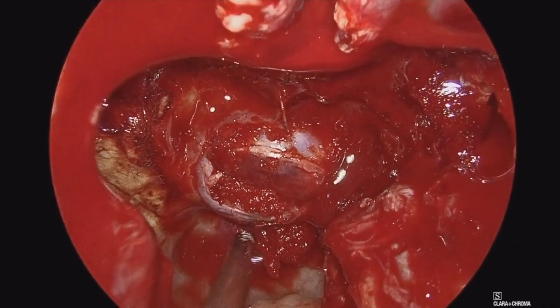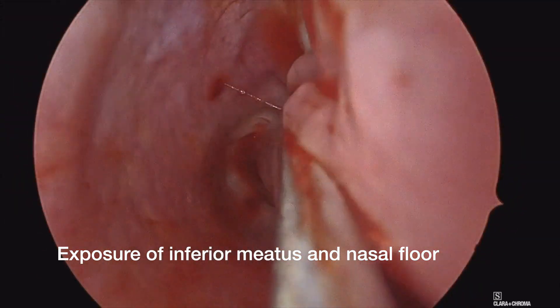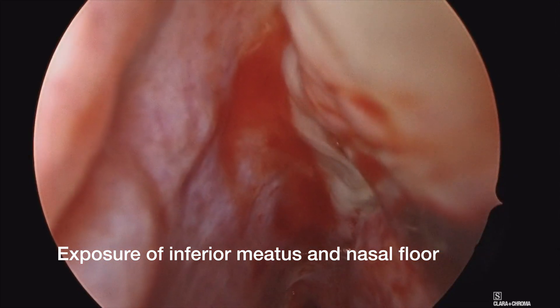This is a fairly standard pituitary approach for us. Then here we are in the right nasal cavity examining the right inferior meatus in order to prepare a harvest of a right nasal floor free mucosal graft.